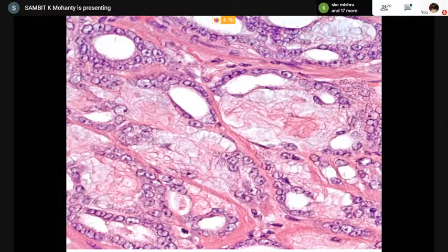This has mucinous differentiation. So whenever you have mucin, you exclude the mucin, deduct the mucin, subtract the mucin, and look at the glands. In prostate cancer, you see the glands are separate from each other, or they're fused, or they're trying to form some complex structure, or they're completely dissolved into an ocean. So accordingly, it is 3, 4, and 5. So here what you see, the glands and lumens are clearly visible, they're separate from each other, there's no fusion. This is 3 with mucin. How about this one?